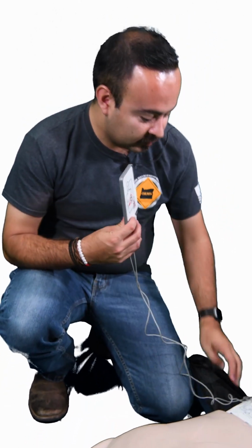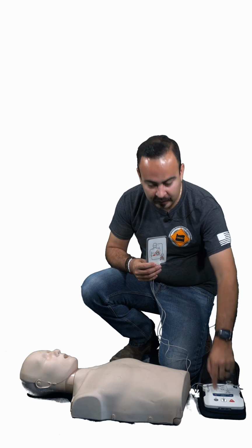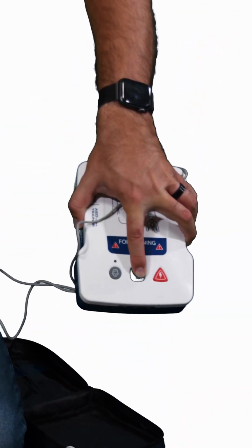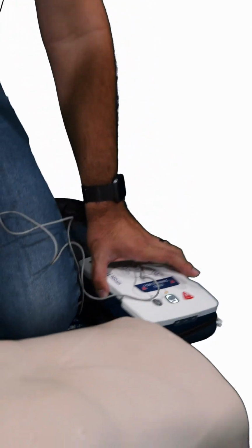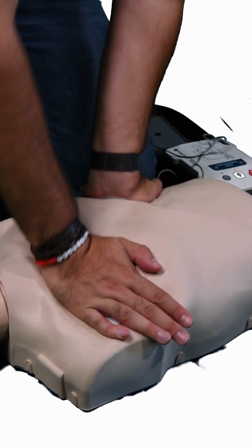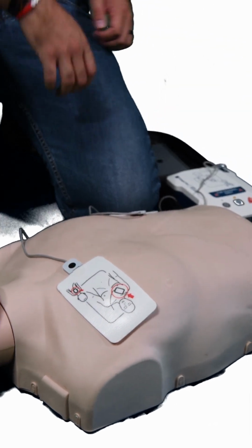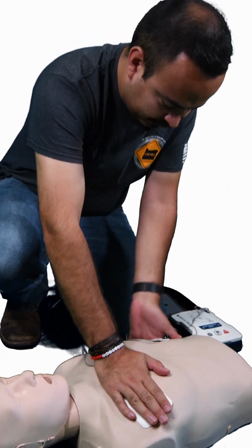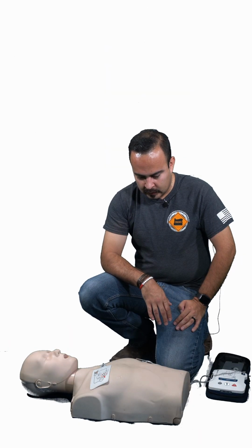So what you first want to do is power on your AED and it'll start giving you instructions. You just press the green button. Adult patient. If the patient is a child, press the child button. Remove clothing from the patient's chest. Press pads firmly on skin. Apply pads as shown in the pictures. Do not touch the patient.